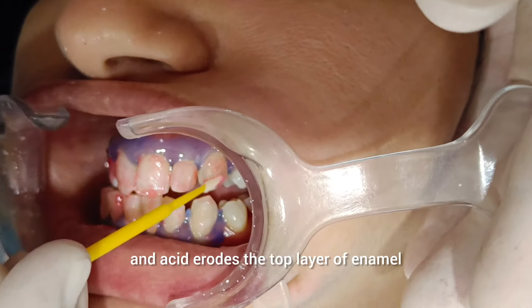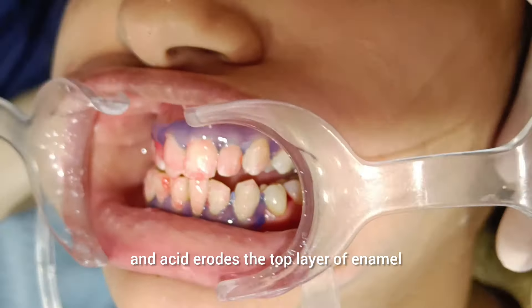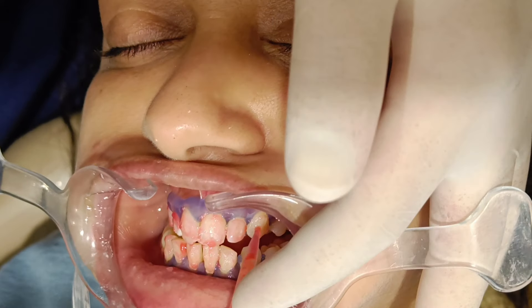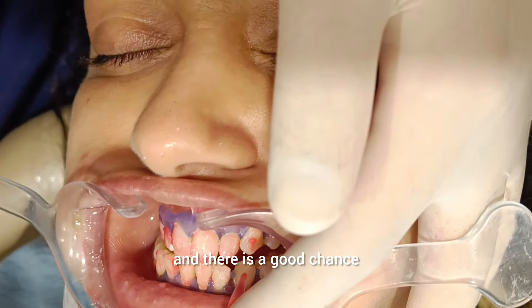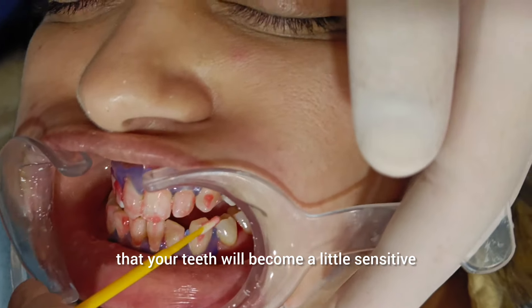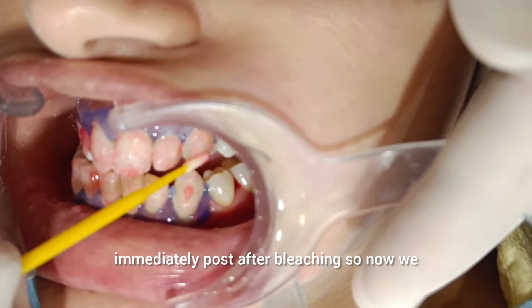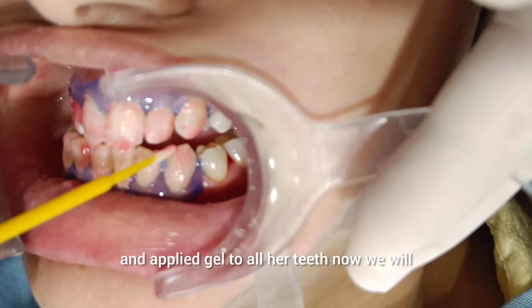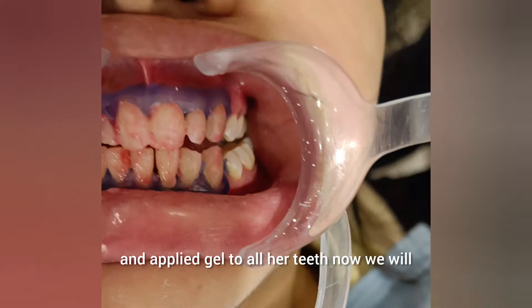This is acid, and the acid erodes the top layer of enamel a little bit. You will feel that your teeth are a little sensitive immediately post bleaching. So now we have done the application and applied gel to all her teeth.